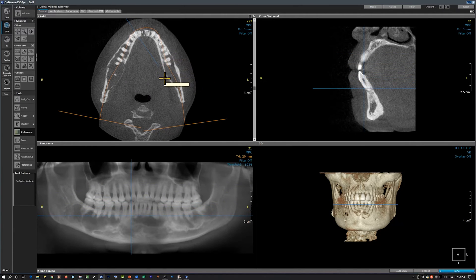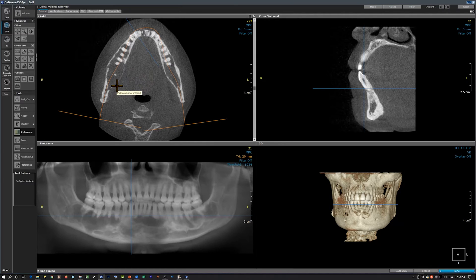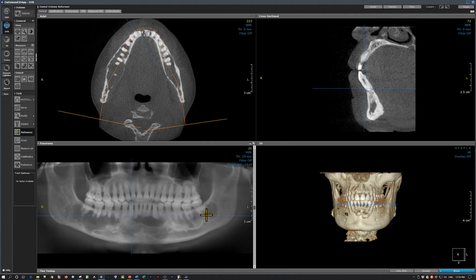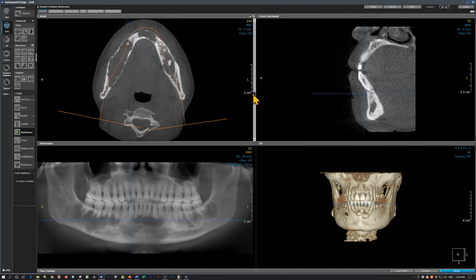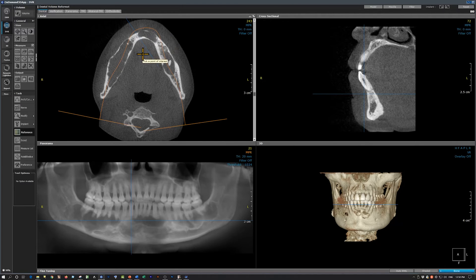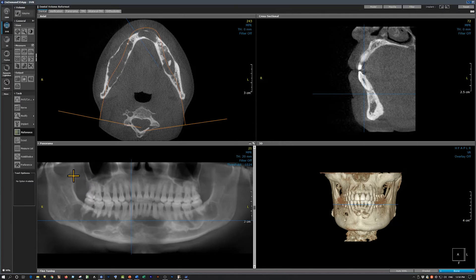Compared to the left side, there is some expansion of the buccal cortical plate and thinning of the lingual cortical plate in the mandible. Moving to the mandibular anterior region, there is a lesion with some expansion of the cortical plates. Let's review the images in coronal sections, starting from the area of the third molar.